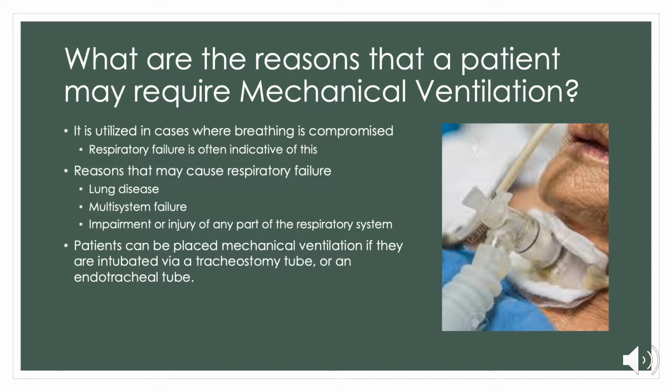A patient may be required to additionally be hooked up to a mechanical ventilator if their breathing is compromised. This is often in the case of respiratory failure or multi-system failure. This ventilation can also be used with both endotracheal tubes or tracheostomy tubes.